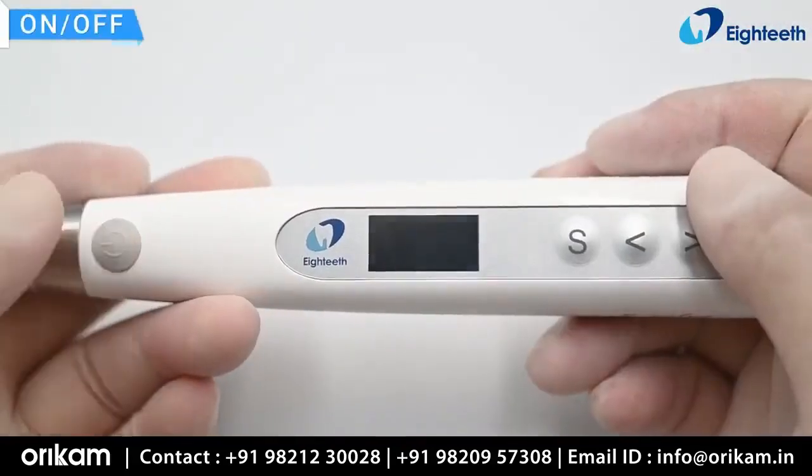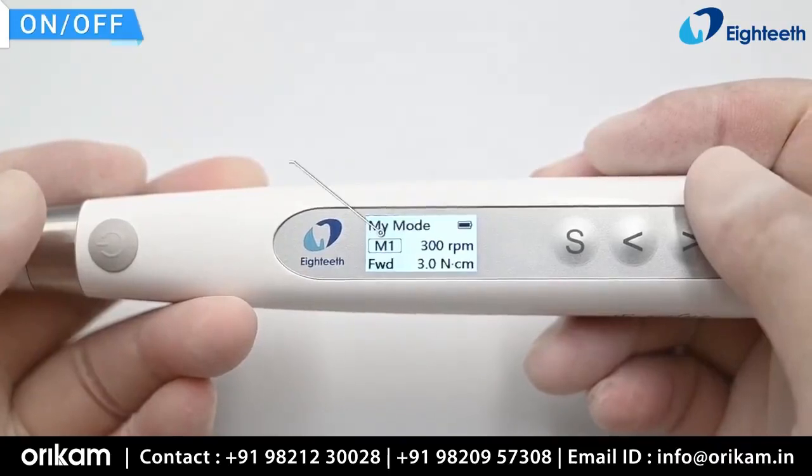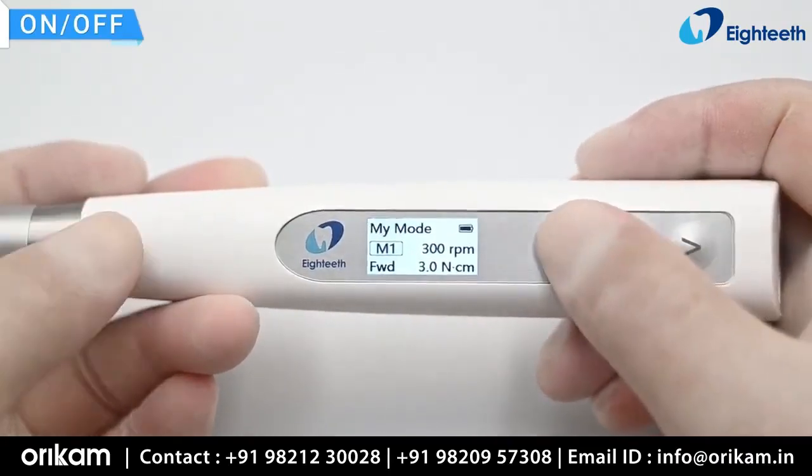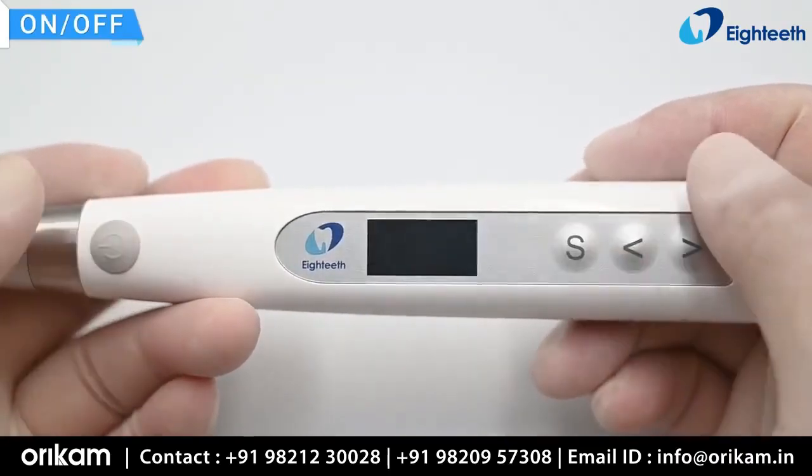Press the main switch to turn on the device. To turn the device off, press the setting button and then press the main switch immediately.